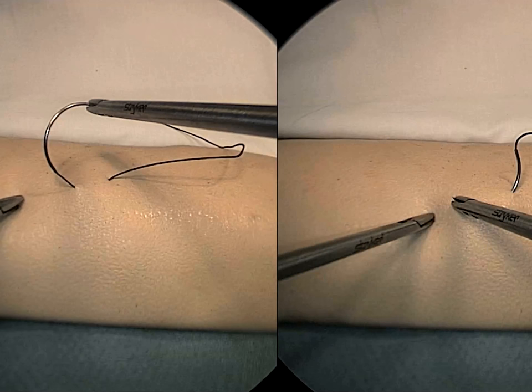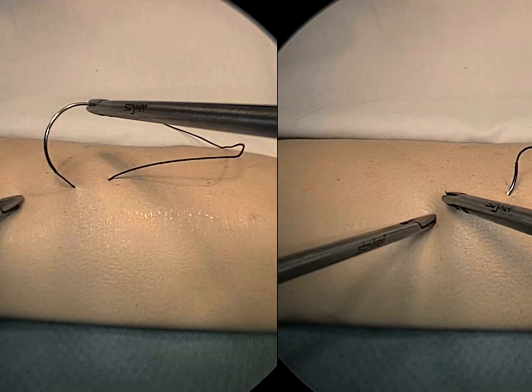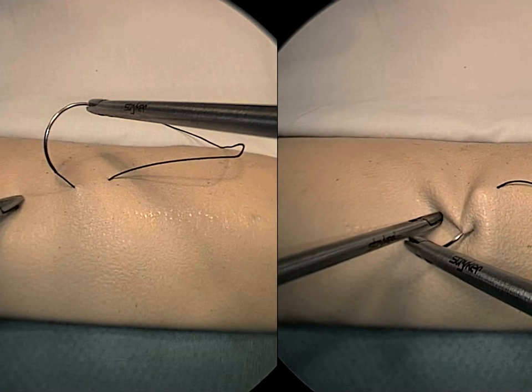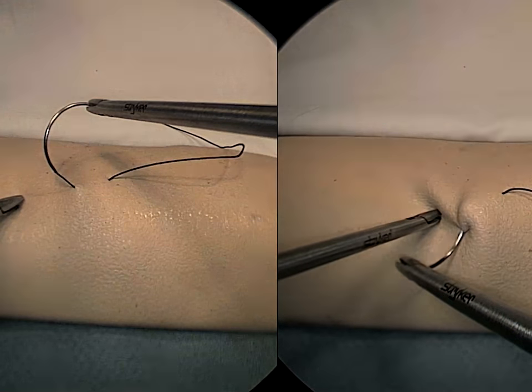In contrast, demonstrated here is failure to pronate the instrument, thus setting up a retrieval unable to follow the needle curve, with apparent risk of tail hook injury.